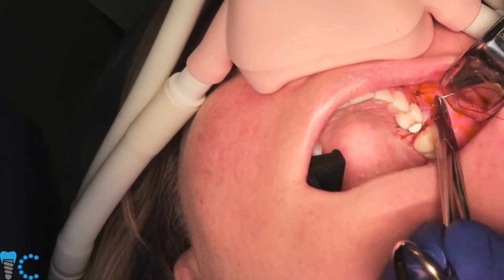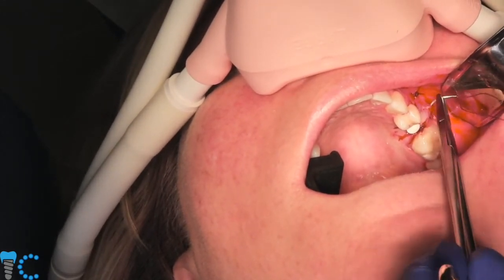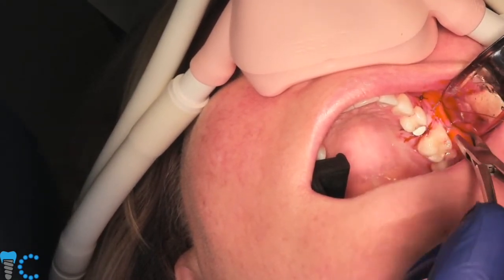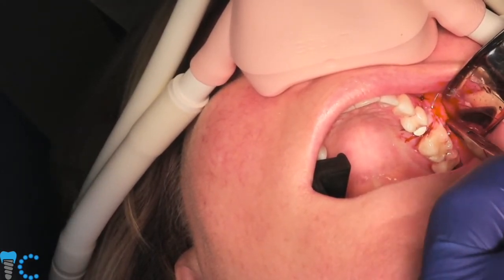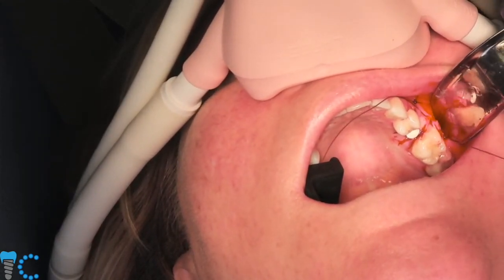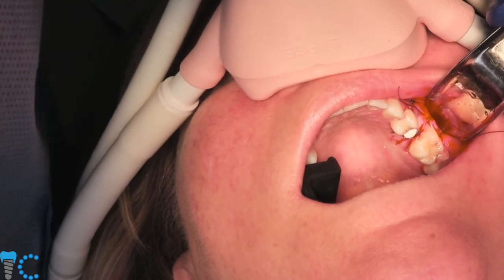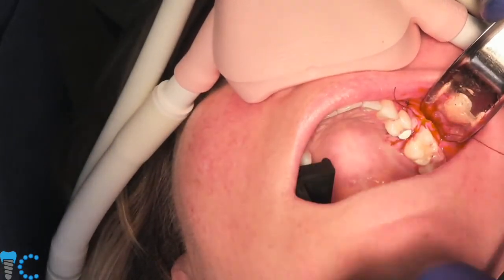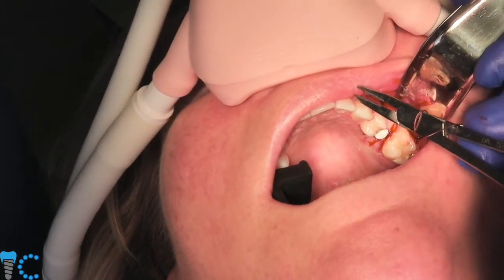So again, when you have less plaque and bacterial adhesion, guess what? A cleaner surface results in more healthy tissue, which periodontically we've known all along. So we finally have an implant that supports healthy tissue. Why would you not want to use it? So it really kind of validates the cost there in comparison to a titanium, in a sense.